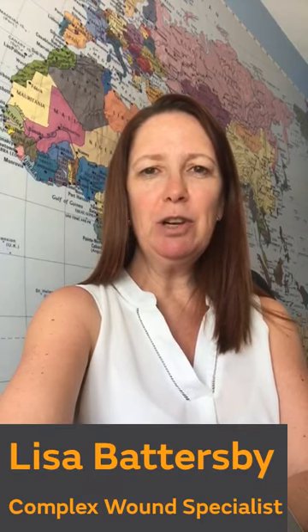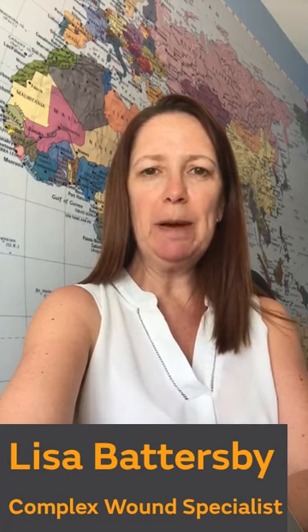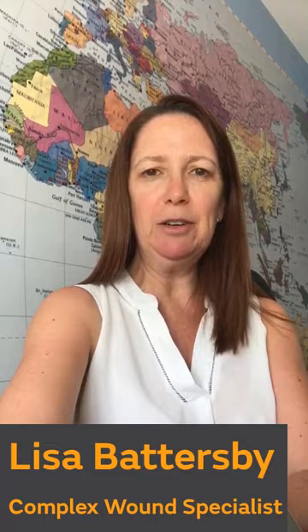I'm here to talk you through a short video on how to manage skin tears using the STAR pathway available from Smith & Nephew.